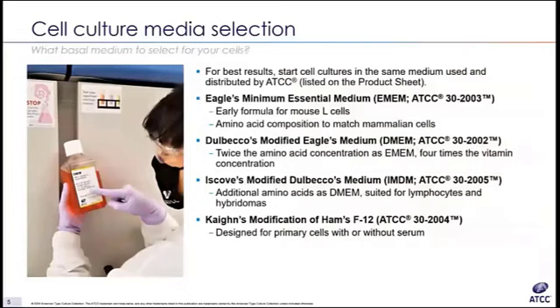Basal cell culture media are a complex mixture of salts, carbohydrates, vitamins, amino acids, metabolic precursors, growth factors, hormones, and trace elements. The requirements for these components vary among cell lines, and these differences are partly responsible for the extensive number of media formulations available on the market today. ATCC currently offers 9 classical basal media formulations. Our basal medias are optimized for the growth and scale-up of ATCC cell lines and are extensively tested to support cell growth for each lot.